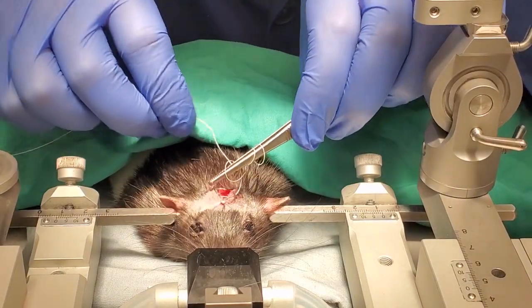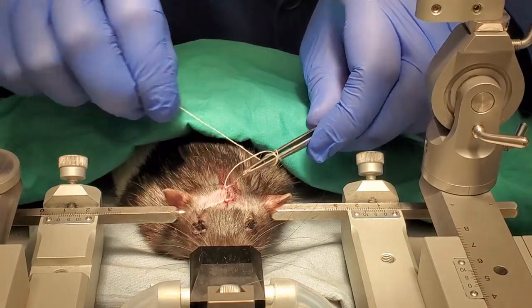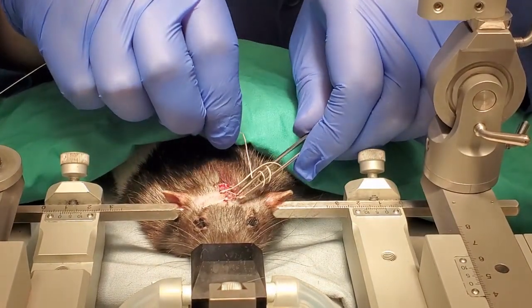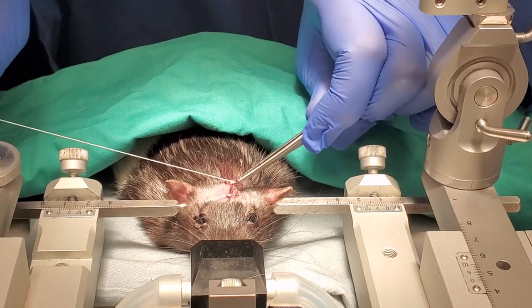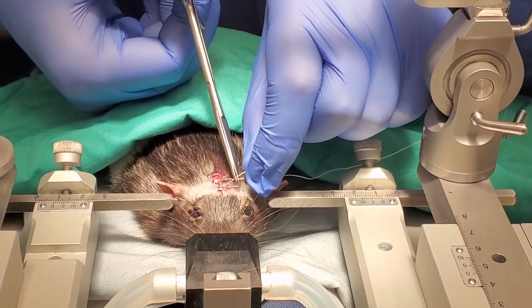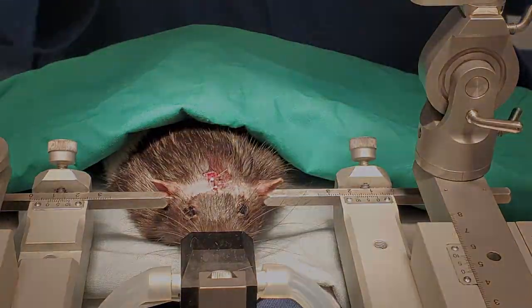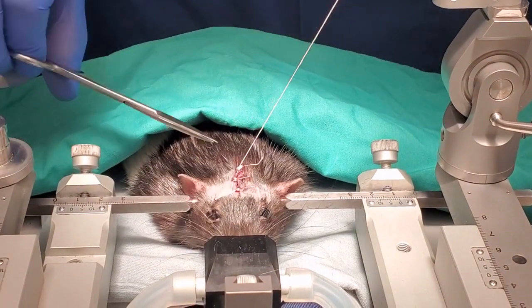Neurotoxic lesions can cause seizure activity immediately following surgery, so rats are assessed for seizure activity and can be given different compounds to help, such as diazepam or gabapentin. After a few hours in the recovery cage, the rat can be safely returned to its home cage. It will receive post-op care for a week after surgery, with daily assessments of its well-being that include a dose of oral analgesic and anti-inflammatory medication.